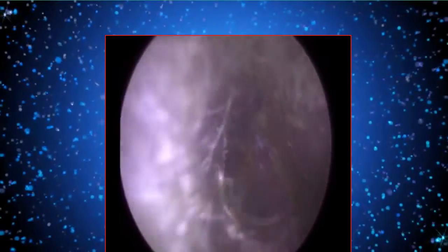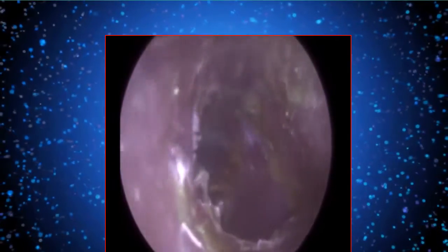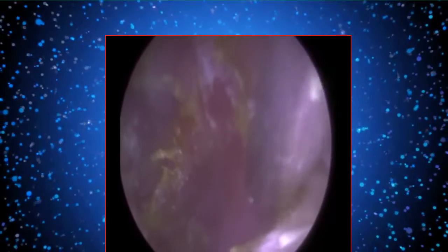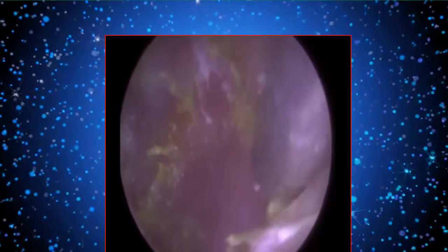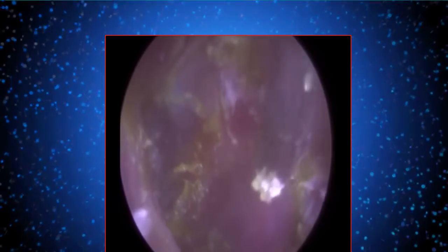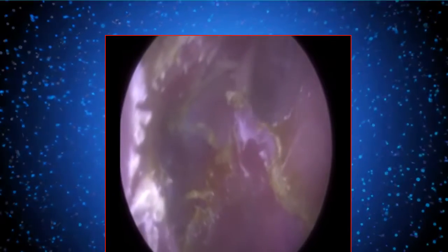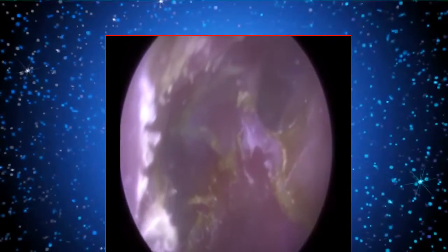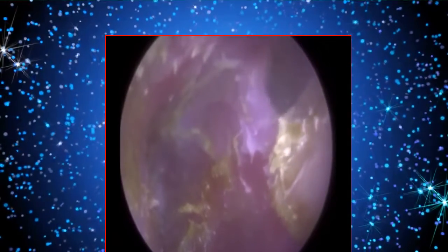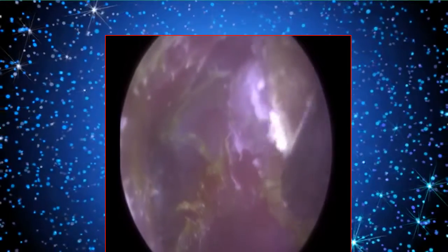You can see the top part of the eardrum there, it's a bit wobbly, it's a bit bouncy, so that's when I had my suspicions that he's also got a glue ear, otitis media, in that side. So there is fluid behind the eardrum here, because the eardrum itself is slightly inflated and inflamed. Just gently on the surface, so you can see here, this is the wobbly bit. So there's fluid behind there. So just kissing the surface, I don't want to puncture that, otherwise fluid will be draining out.